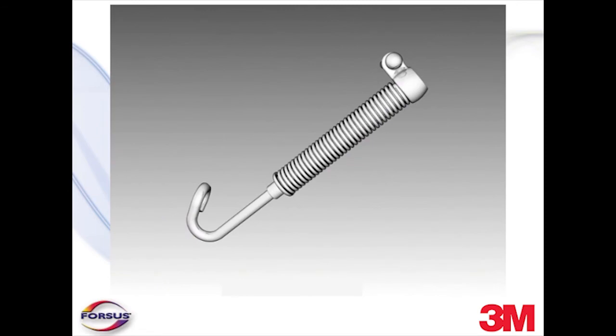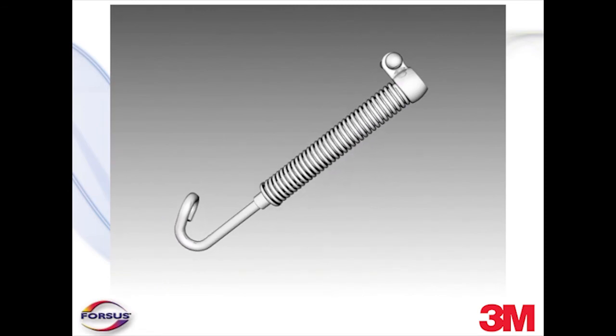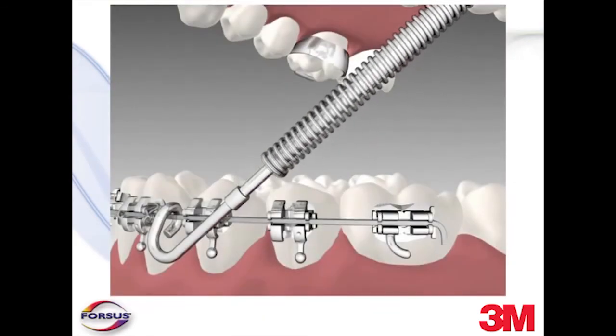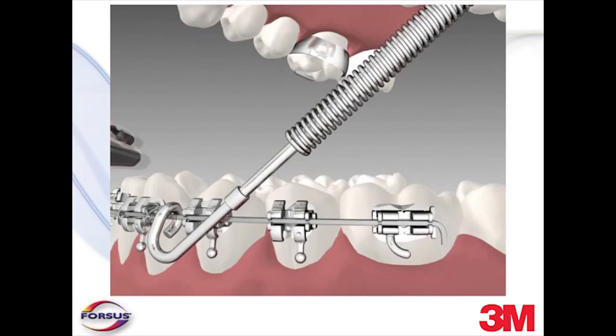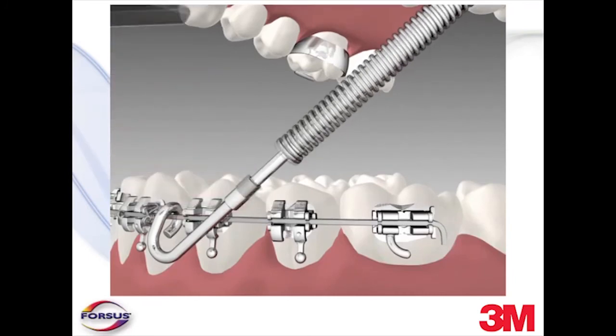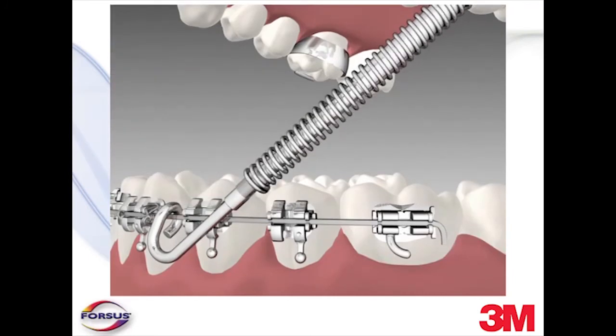Over time, as the Class II malocclusion is corrected, the spring deflection is reduced. To reactivate the spring module, use the split crimps provided by the Forces corrector kit. Compress the spring so that the pushrod is exposed and place the split crimp distal to the stop on the pushrod. Secure the crimp onto the pushrod — this will provide two millimeters of activation. If greater activation than two millimeters is required, replace the pushrod with a longer pushrod.